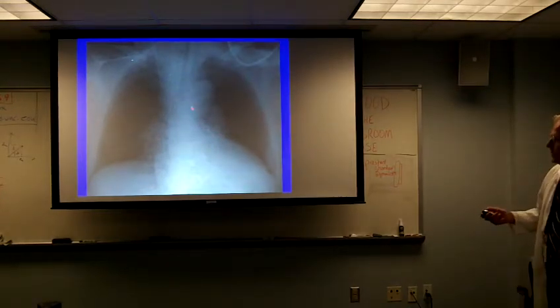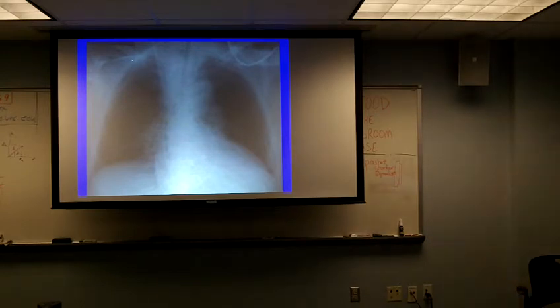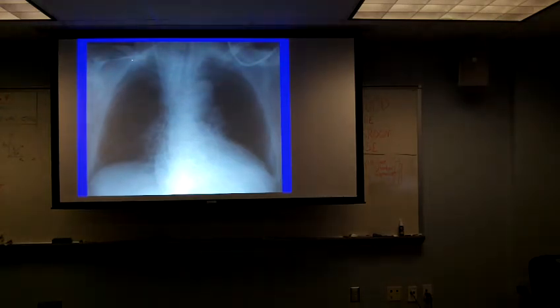This is the nasogastric tube that has been, it looks great on my monitor. I'm not sure how great it is for you all. I can see it. Okay, so here's the nasogastric tube coming down right into the right mainstem bronchus and the bronchus intermedius.